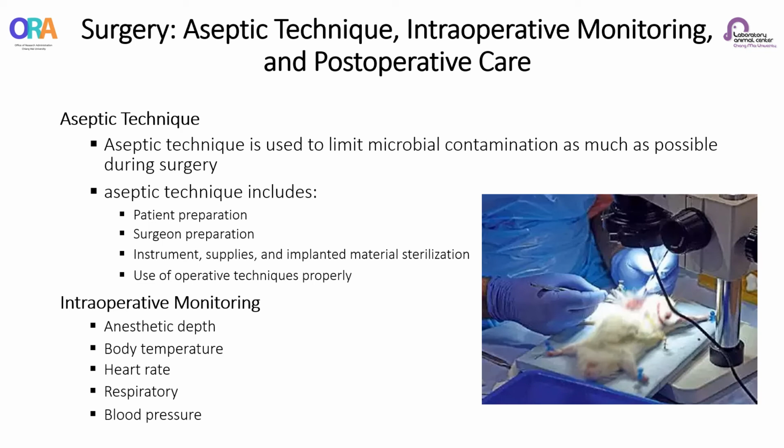Aseptic technique is used to limit microbial contamination as much as possible during surgery. Aseptic technique involves many practices and procedures and requires the input and cooperation of all personnel who enter the surgery area.